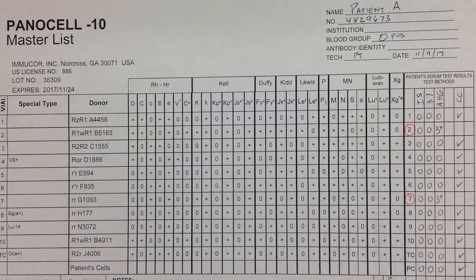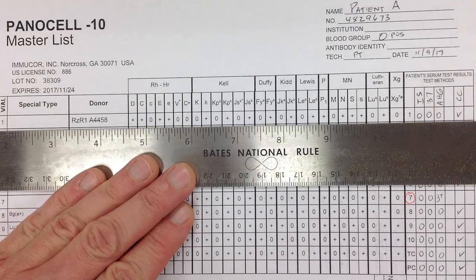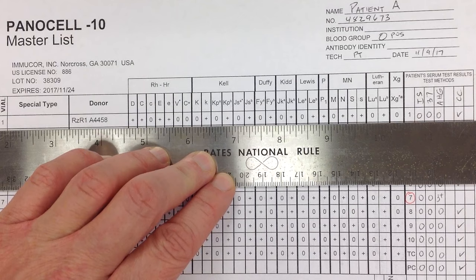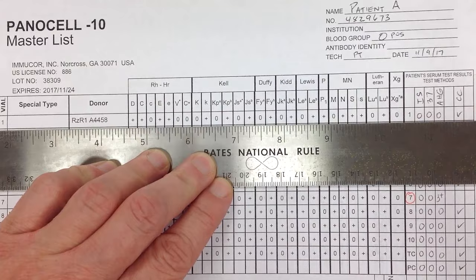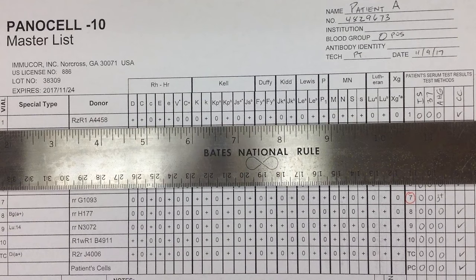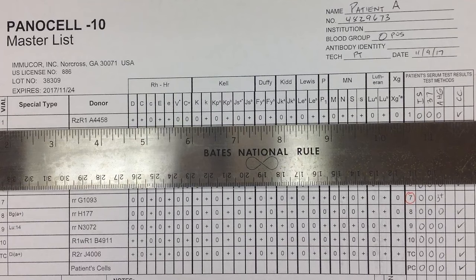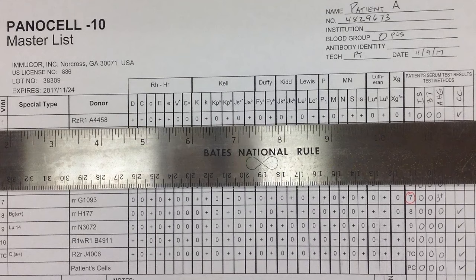The next step is the ruling-out step. You have all these boxes and all these pluses and minuses — I always like to use a piece of paper or ruler to keep me on the right line, because it's very easy to get mixed up. We're going to look at the negative cells or the negative vials. The way I'm doing this is how I teach my students — it is not the only way. If you're a student of laboratory science in blood bank, follow your instructor or clinical site's standard operating procedure.